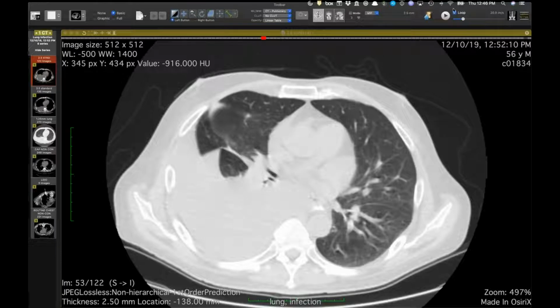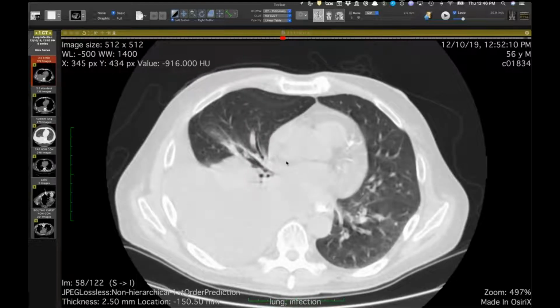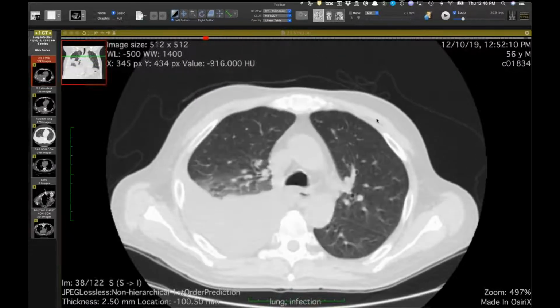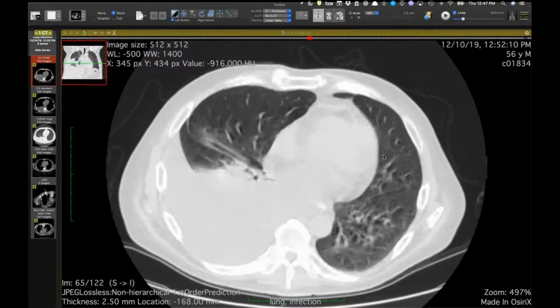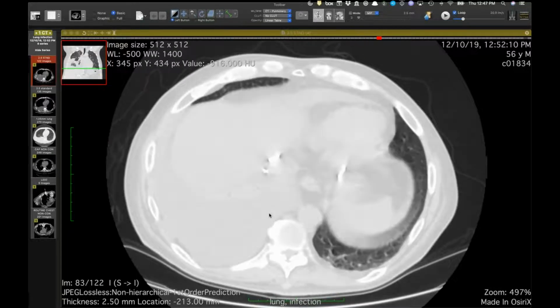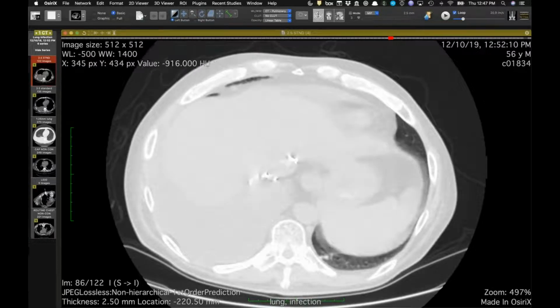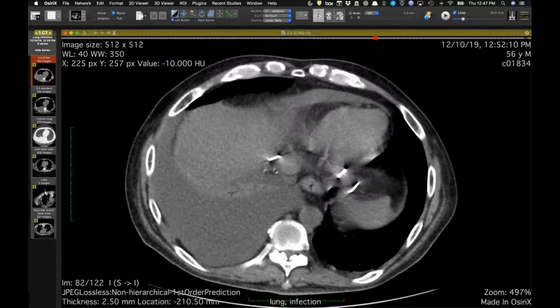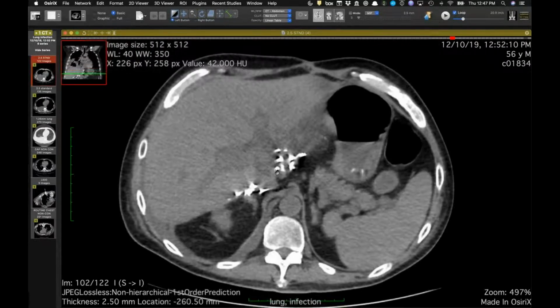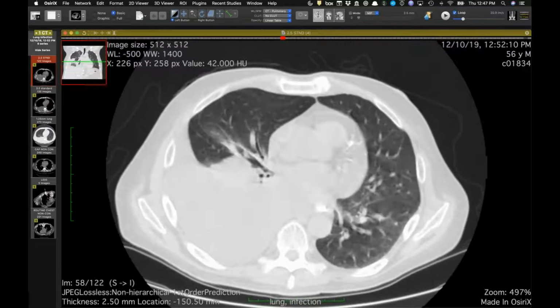All right. You see a CT. This one is for David mostly. This is back in December. This is a patient, this is just kind of baseline. Patient has a moderate-sized right pleural effusion that's probably just hepatic hydrothorax. They've had a prior liver transplant. Of course, that's part of the important history here. So nothing else really going on.